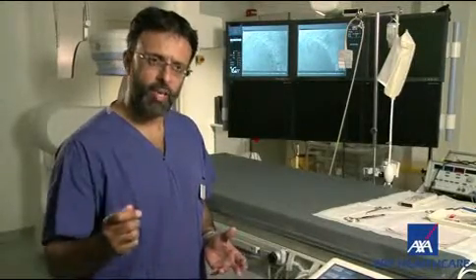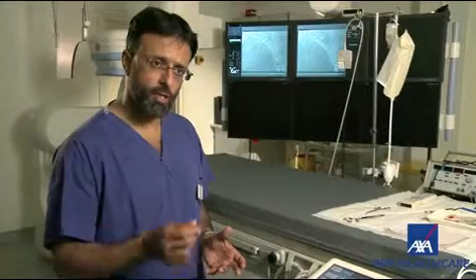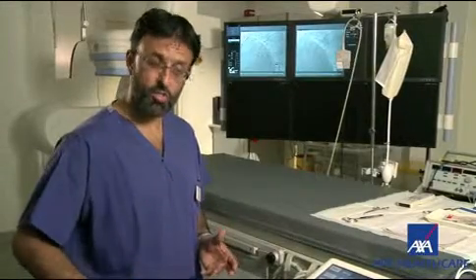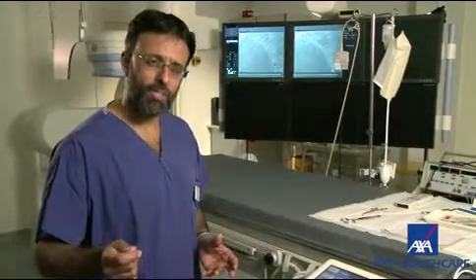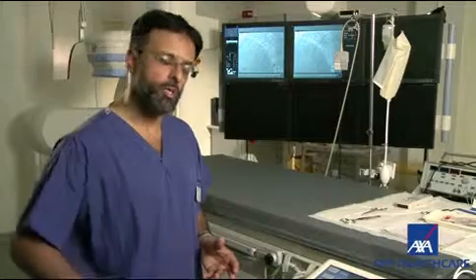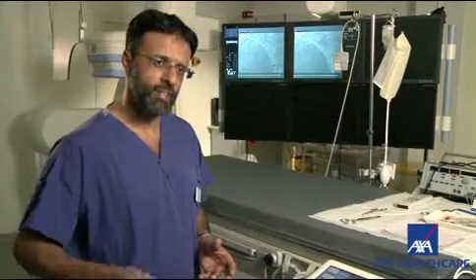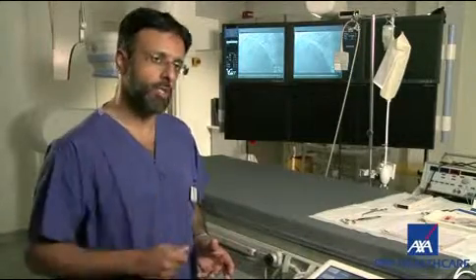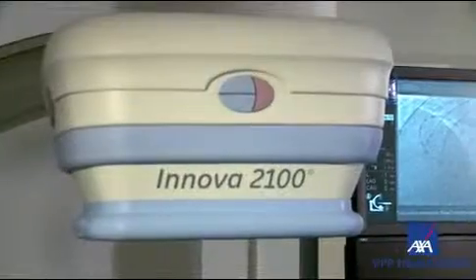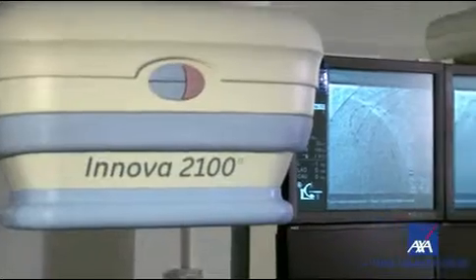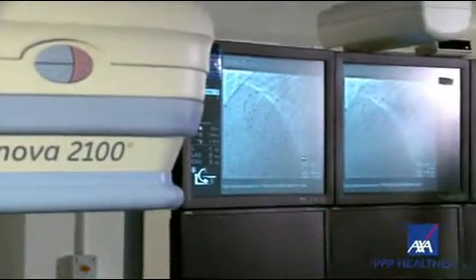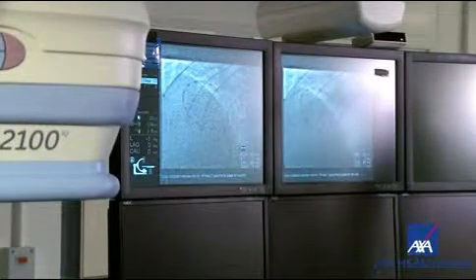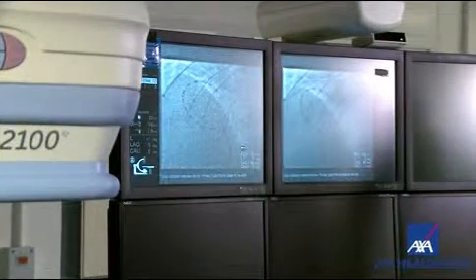We then place sheaths, which are small tubes that allow us to get access to the vein, and we place wires into those sheaths and track them all the way up to the heart. We use the x-ray imaging system that you see behind us in order to place the wires in the correct position within the heart.